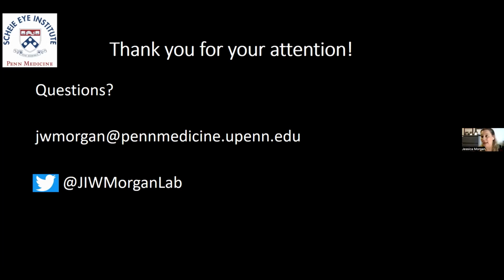Sure. Thanks for the question. It is definitely easiest for our image collection when people can fixate and eye motion is minimized. I can tell you not just from work with choroideremia, but in other inherited retinal degenerations where the eye motion is not as steady, we're still able to get results like this. We have had people, even with mild nystagmus, undergo these experiments and obtain successful results. As our technology improves, in particular with eye tracking capabilities, I become less and less concerned that in the long term we'll be able to undertake challenging conditions. Let me clarify something, though, related to outcome measures.